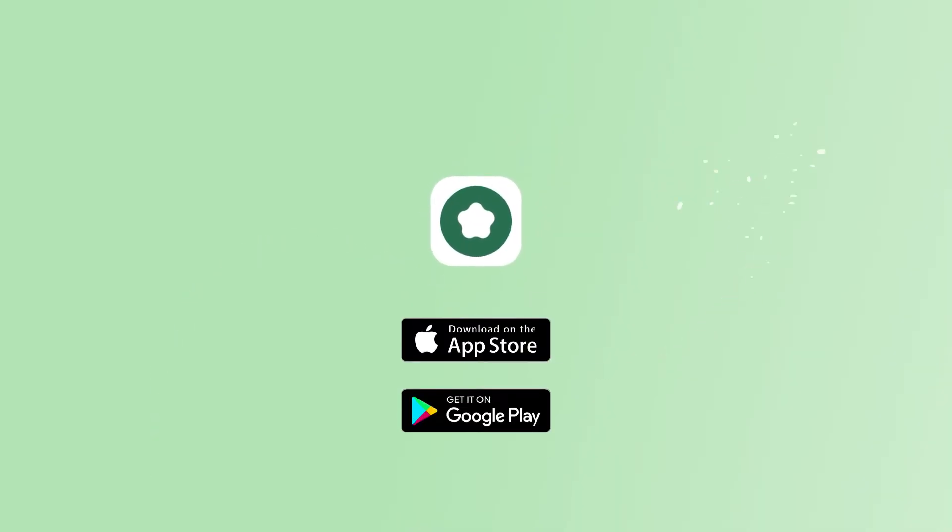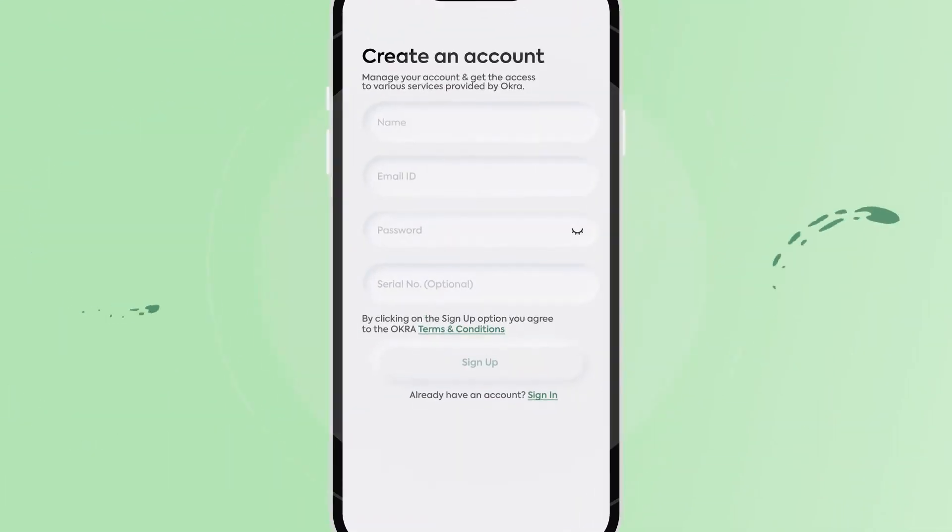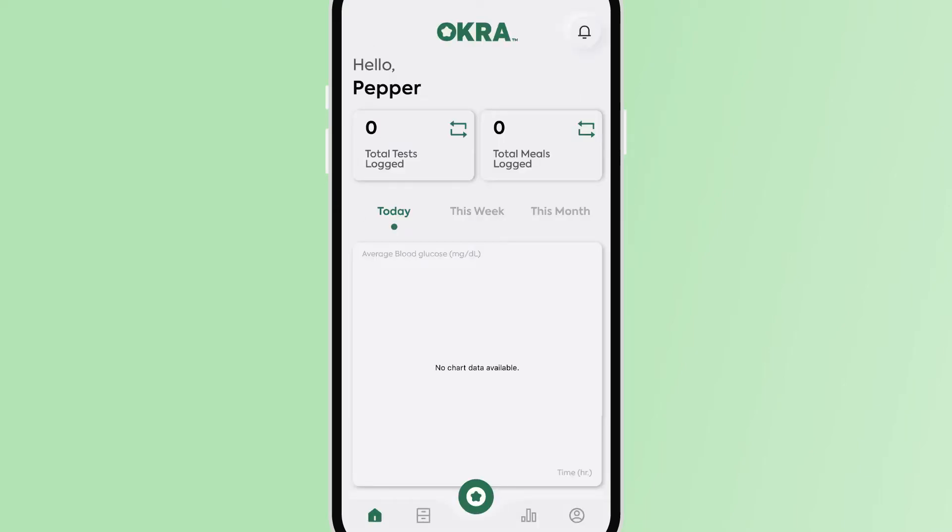You can find the Okra Pro app on the App Store or the Play Store. Once the app has been downloaded, please sign up and log in to start gaining access to your new Okra Pro Diabetes Management.